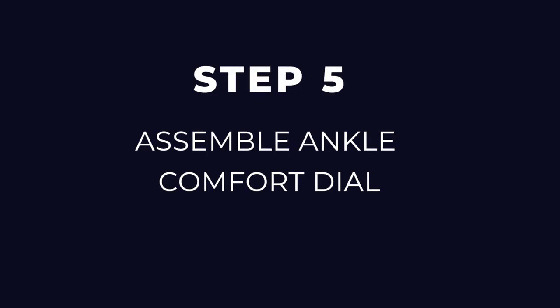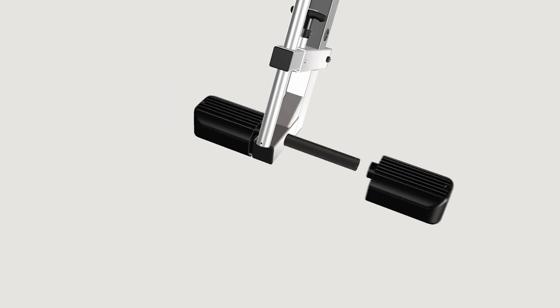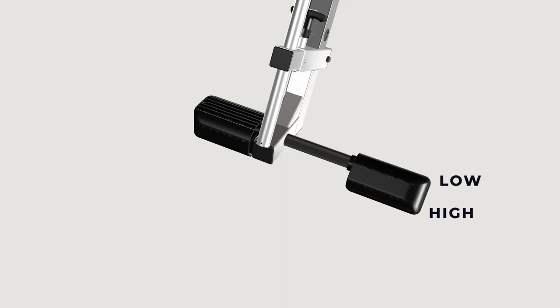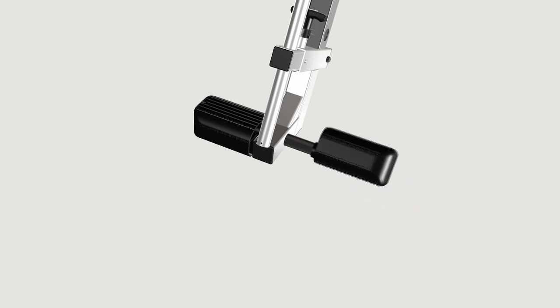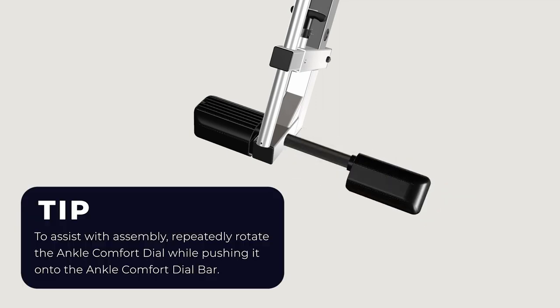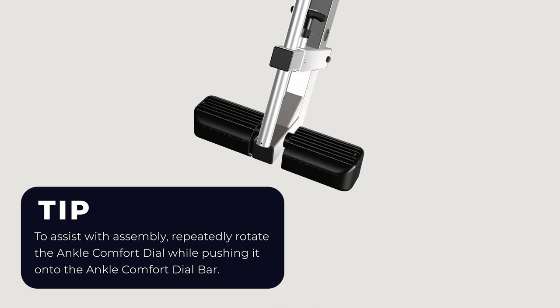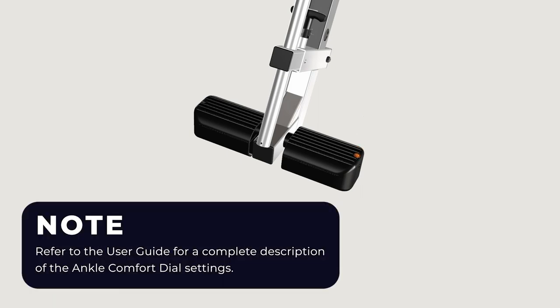Step five: assemble ankle comfort dial. Use the ankle comfort dial hardware kit to assemble the ankle comfort dial. Slide the ankle comfort dial bar with pre-assembled ankle comfort dial into the hole at the front base of the main shaft. The ankle comfort dial is designed with a high and low setting. Position the pre-assembled dial in the low setting with screw holes facing up for ease of assembly. Slide the separate ankle comfort dial onto the ankle comfort dial bar and align the screw holes. To assist with assembly, repeatedly rotate the ankle comfort dial while pushing it onto the ankle comfort dial bar. Secure with the screw and tighten with the screwdriver provided. Please refer to the user guide for a complete description of the ankle comfort dial settings.